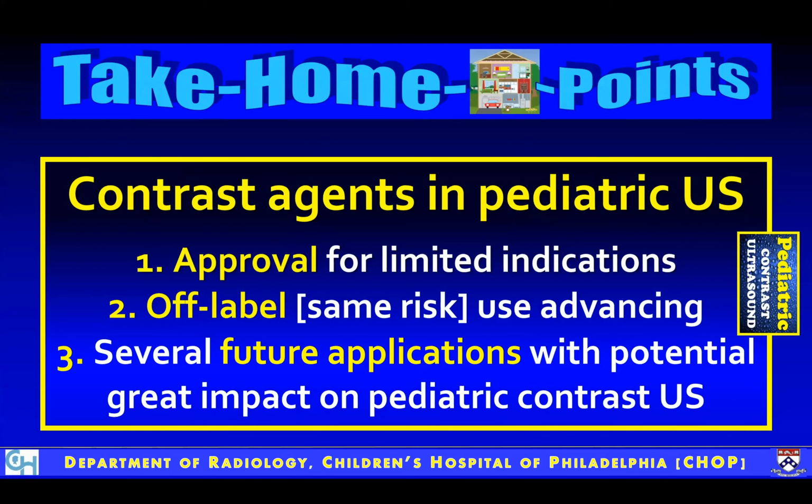So I just want to close by saying the contrast agents in pediatrics have now been, luckily in the US, approved for limited indications since 2016. But since then, the off-label use has greatly advanced, and in centers like ours, we're working on different applications of contrast ultrasound in children.